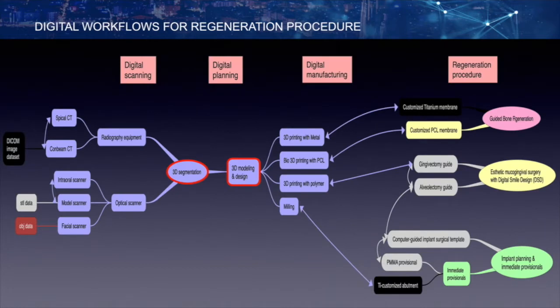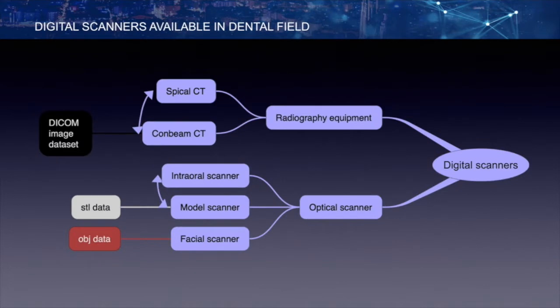This is all I have to say today. First, I will show you various digital scans and I will talk about digital planning. I will explain it by showing you the cases of GBR using a patient-specific membrane and aesthetic mucogingival surgery using a smile design. Let's start with the digital scan.